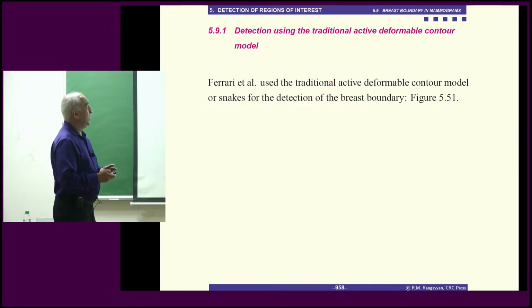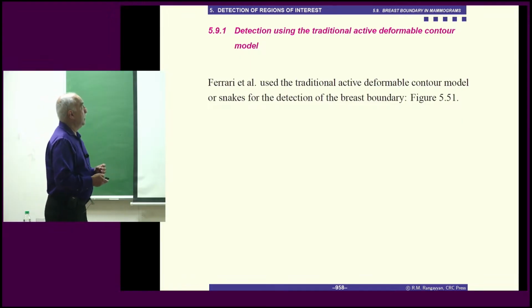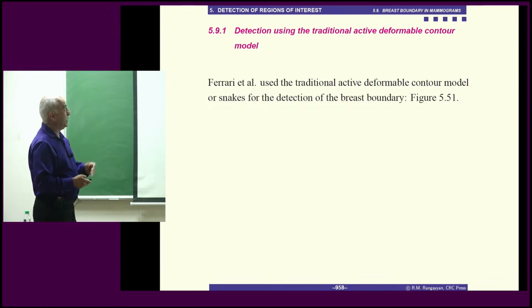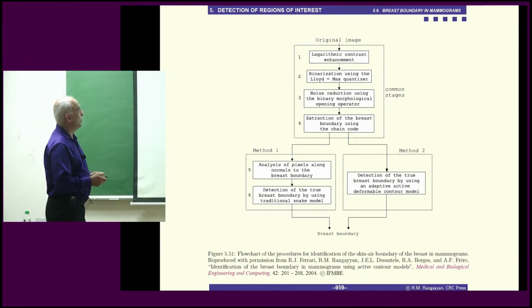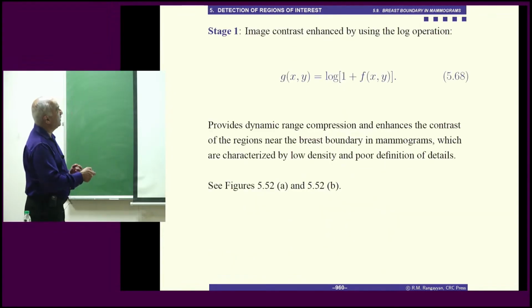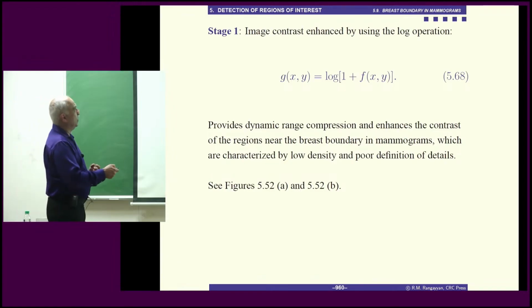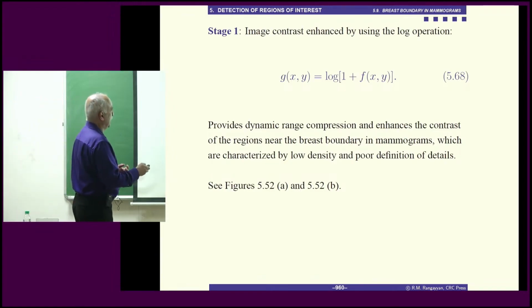So Ricardo Ferrari from Brazil did his PhD work with me and his supervisors in Brazil on this topic. First we started with the traditional active contour model or snakes, and he included this active deformable contour model. I'll go through the procedure. The image contrast is first enhanced just by taking log, and to avoid taking log of 0, you just add 1. That's not a big deal.